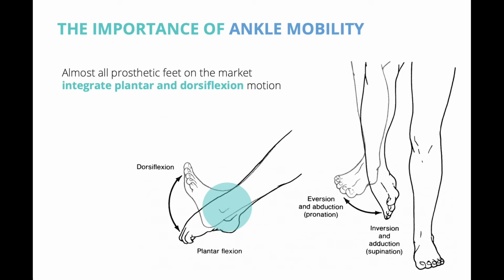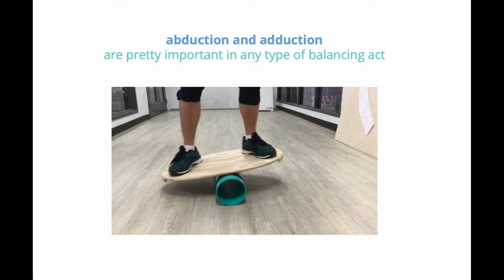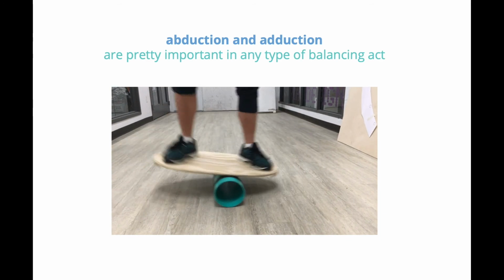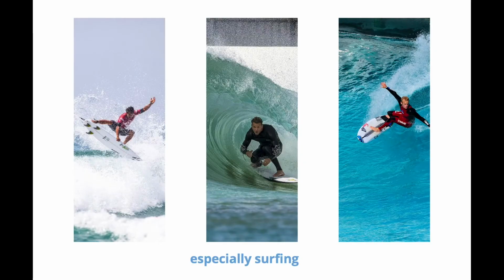Ankle mobility is important, and most of the time it goes unnoticed, but not for those without a limb. Almost all the prosthetics on the market integrate plantar and dorsiflexion motion, but the affordable, waterproof ones lack abduction and adduction. Abduction and adduction are pretty important in any type of balancing act, especially surfing.